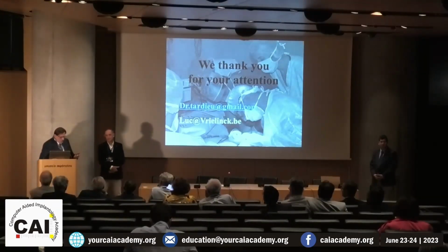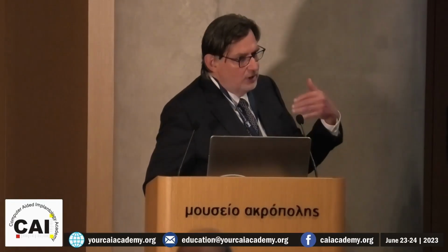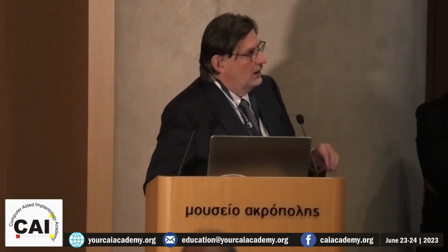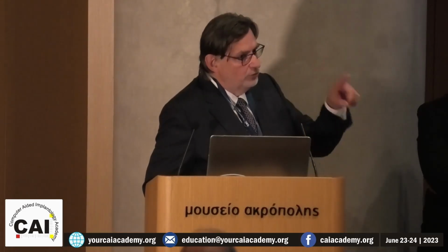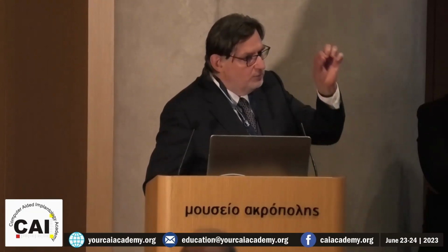But I also think that some aspects of artificial intelligence are very useful. For example, I'm used to using DTX from Nobel Biocare. And there is some piece of artificial intelligence because it draws the nerve automatically. In the beginning, I was not sure. Actually, for many years, my wife has always been drawing the nerve in the scan.